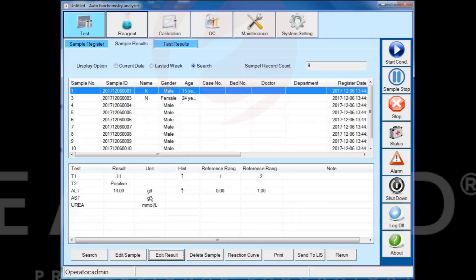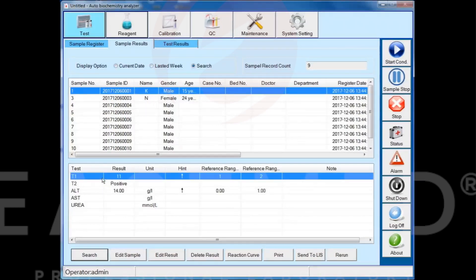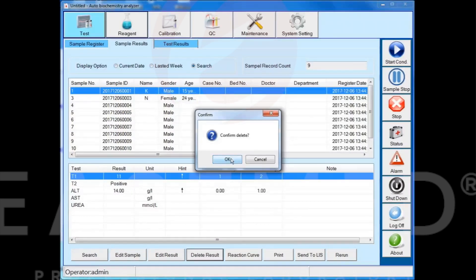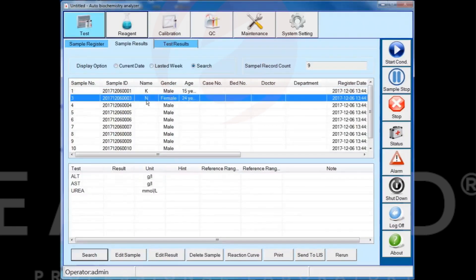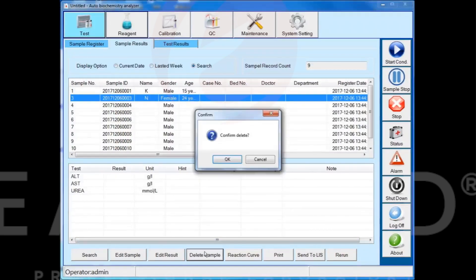Select the test item and click the delete result button to delete the test results. If you select a sample information and click the delete sample button, it will delete the entire sample information.